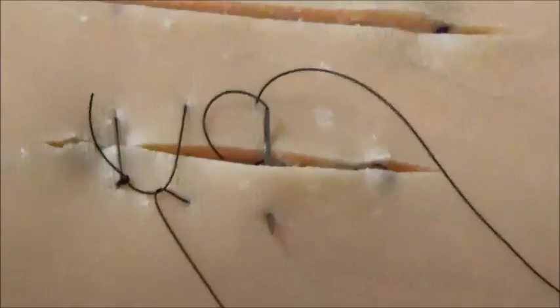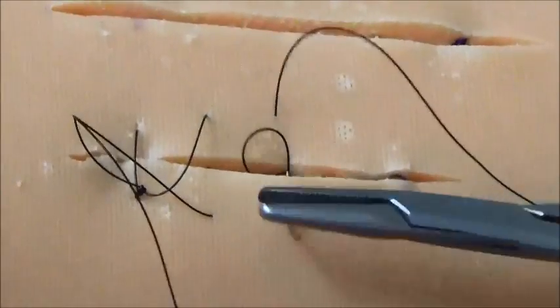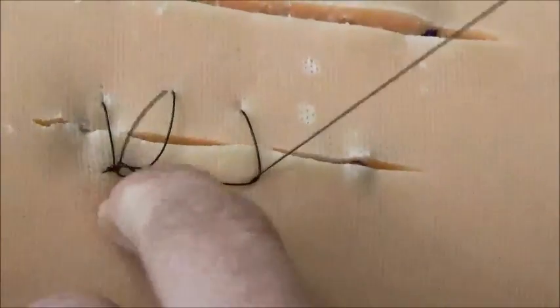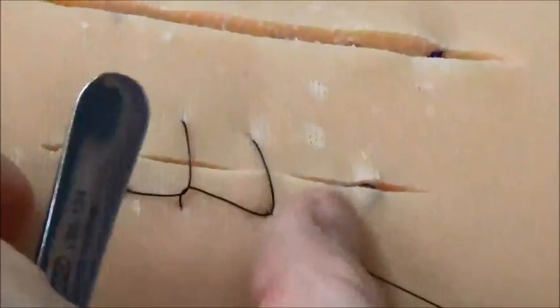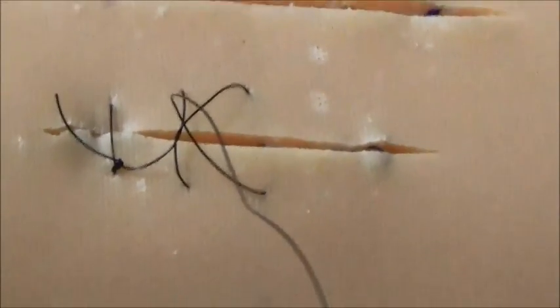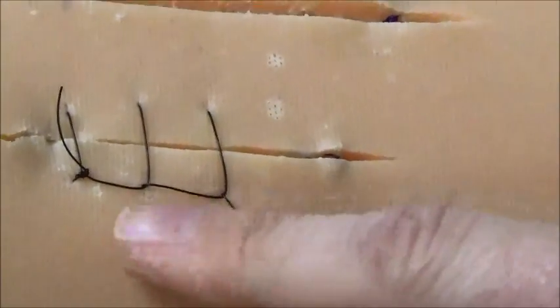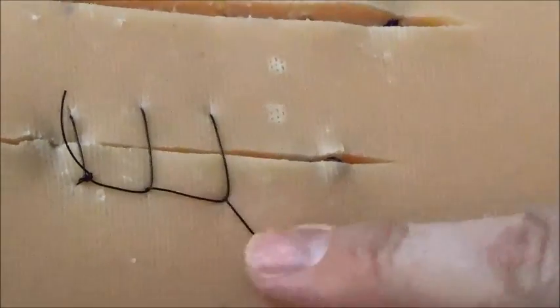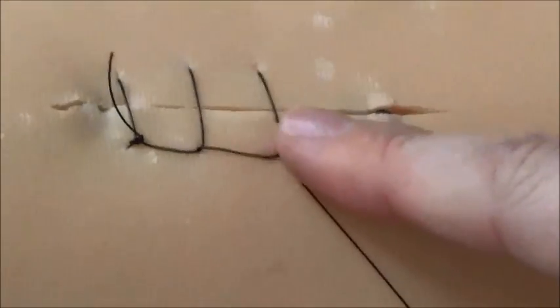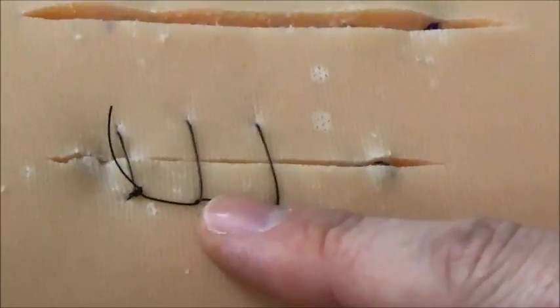The reason that this stitch is done from non-dominant to dominant is because it allows this loop to fall naturally sort of in your way so that it interlocks a little bit easier. One advantage of this pattern is that if you lose one knot on the line, there's a possibility that you won't lose the entire line because the interlocks may hold. When you're looking at these, you want them to each be square rather than rectangular. So I could have gone a little bit farther down the suture row before placing this one because you can see it end up as a little bit of a rectangle.